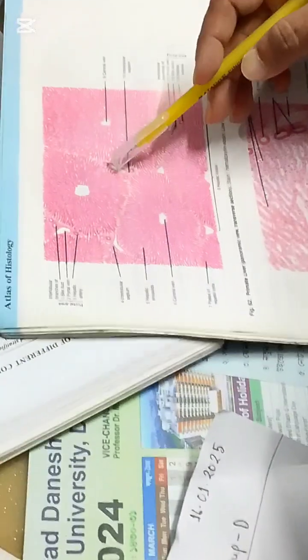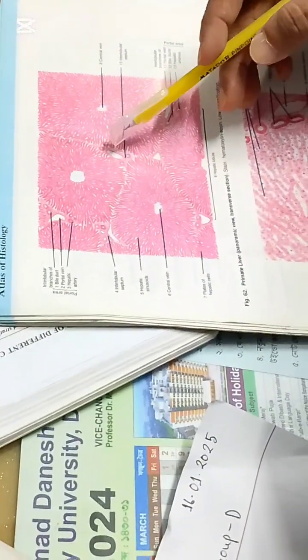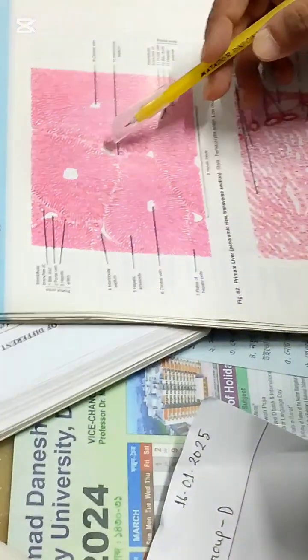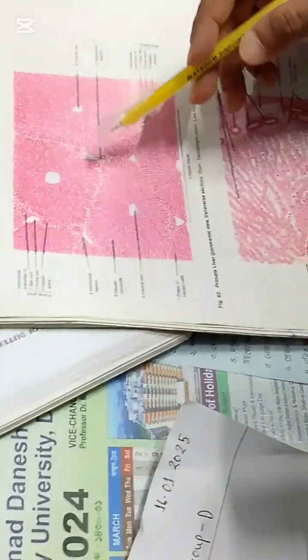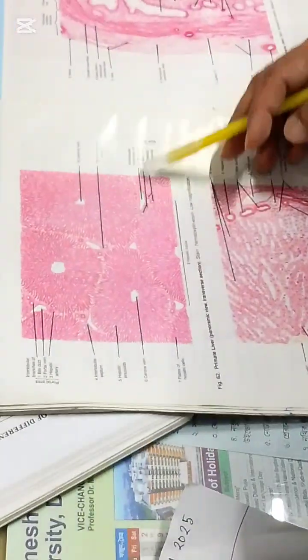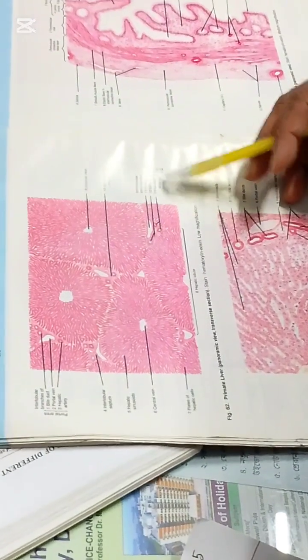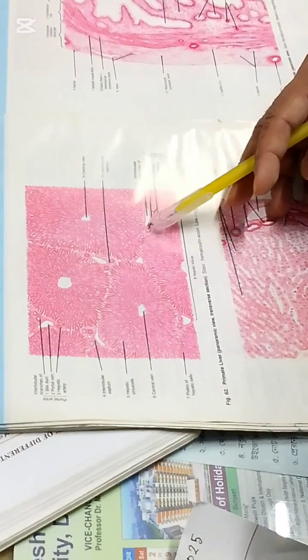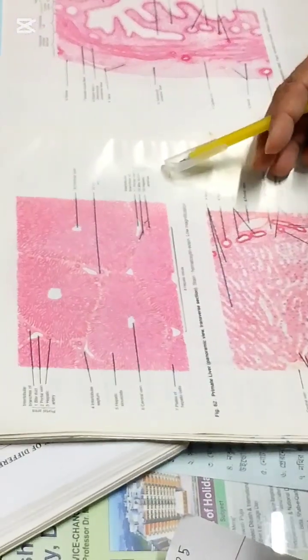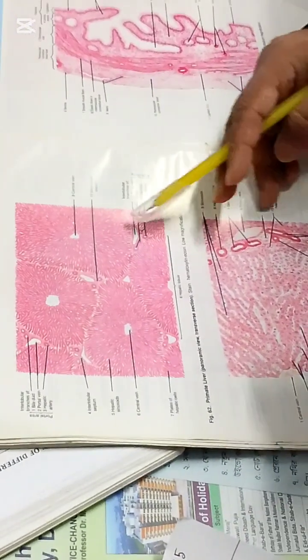In the corner portion of each hepatic lobule, there is a portal triad, where hepatic arteriole, portal vein, and another one, bile duct. This is a bile duct, hepatic artery, and portal vein. These three structures are commonly called portal triad. This one portal triad.